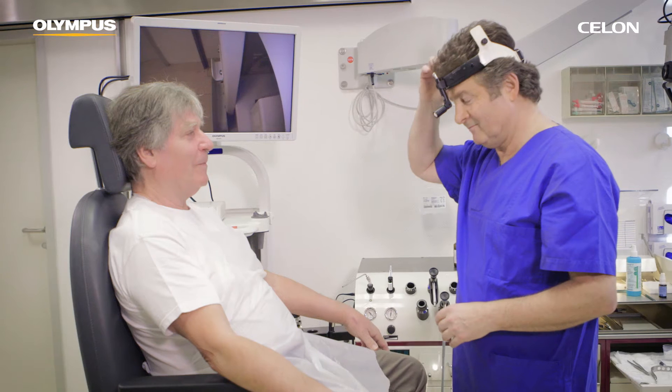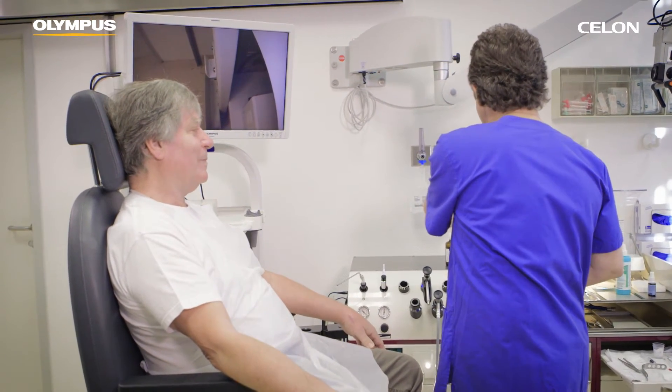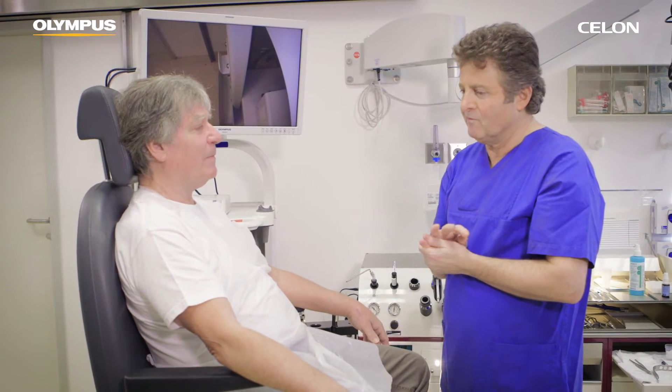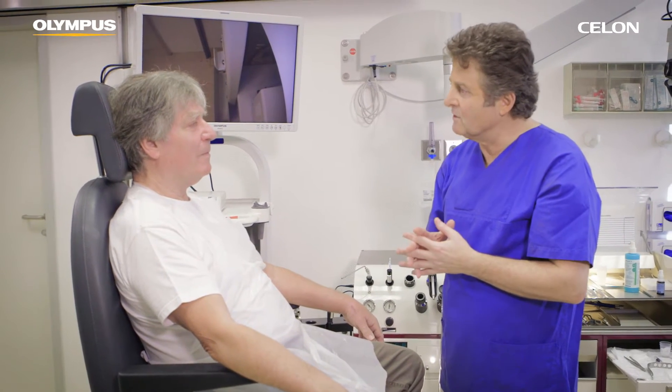Post-operative swelling and some pain may occur and can be treated with ibuprofen, for example. Clinical experience indicates that additional coagulation treatment of the soft palate is usually necessary to achieve optimal results. When conducting additional treatments, the Ceylon applicator should be placed between the scarred areas of the tissue. A follow-up intervention should only be conducted after a period of at least four weeks.